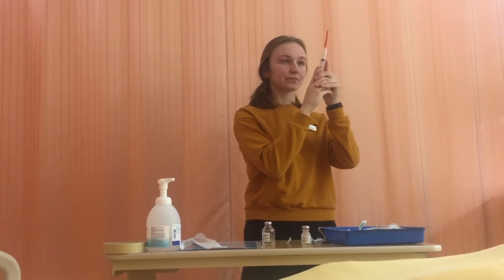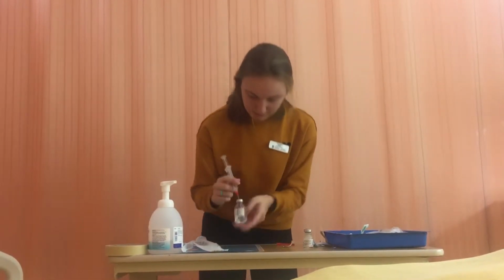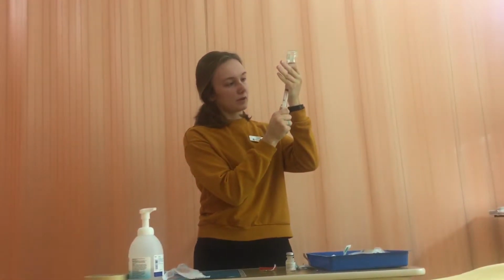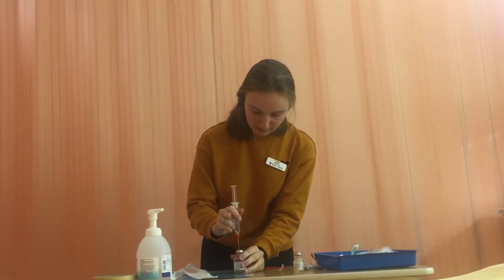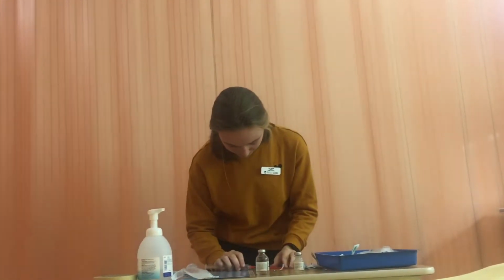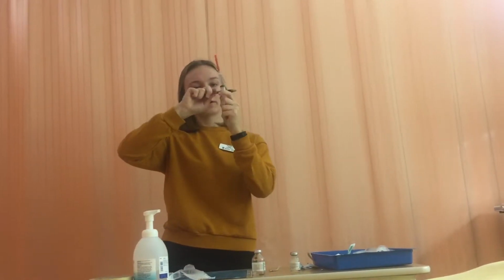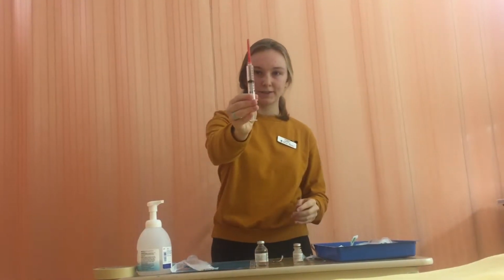So now I'm going to draw back 6 milliliters of air, and I'm going to inject the air into the medication vial, and I'm going to draw back 6 milliliters of fluid. So I have my 6 milliliters of medication, and I'm going to use the scoop method to recap, and I'm just going to tap out any air bubbles to make sure that we have the right dose. And I have 6 milliliters. I would just waste that over the medication waste bin. So we have 6 milliliters, as you can see here.